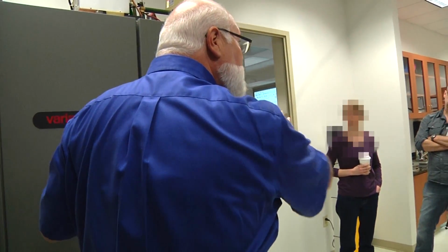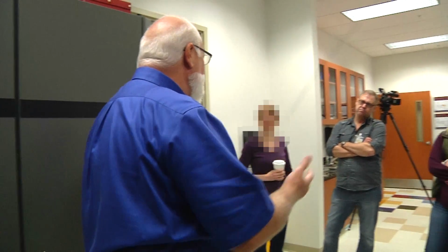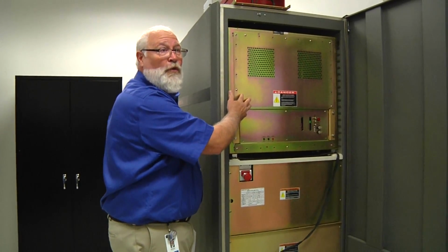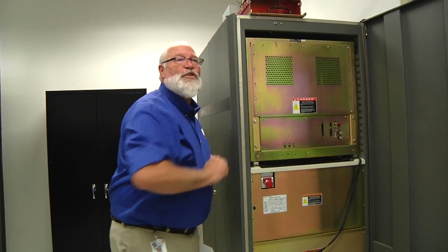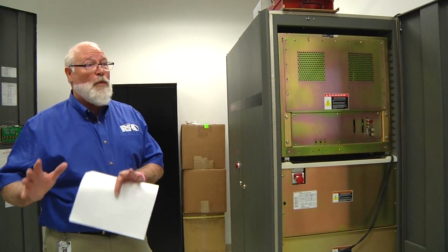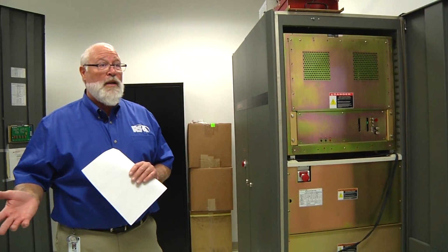The rest of the modulator, you shouldn't have to play in there. You shouldn't have to take off any covers. There's always safety covers. So any place where there's high voltage, there's going to be a safety panel covering it. Now we might ask you to grab a flashlight and look in through the screen, see if you see anything burnt or whatever. A lot of times if you're in smaller departments, your engineer could be a 3-4 hour drive away.